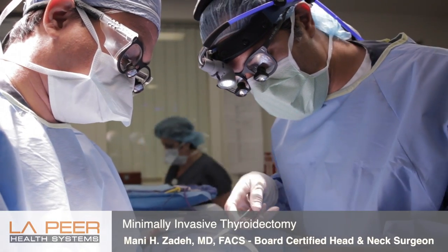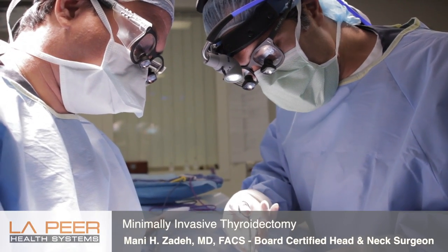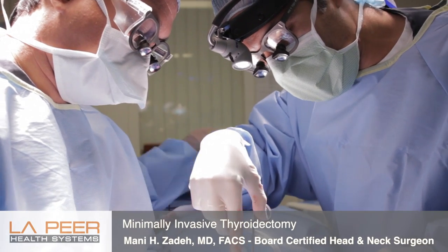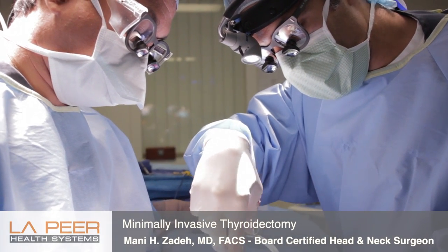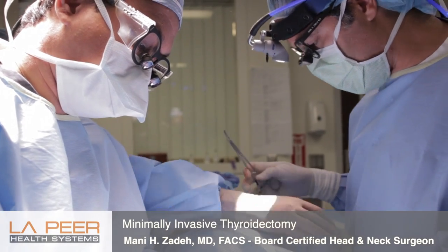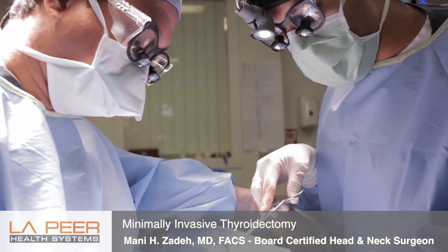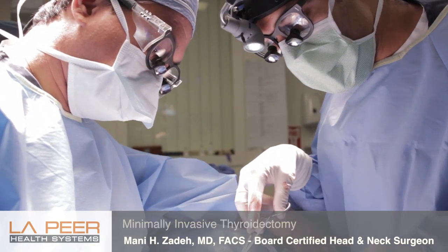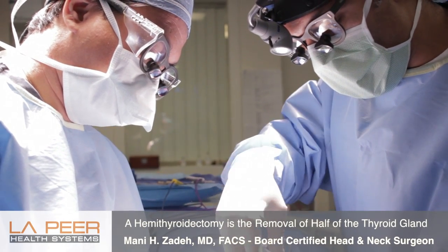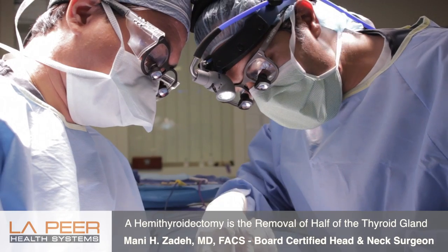This is a young lady who has a left thyroid lesion. It's been biopsied — it's cystic and complex, a large lesion with a suspicious biopsy. We're doing a left hemithyroidectomy, mostly for diagnostic reasons, and also because she was having some compressive symptoms.